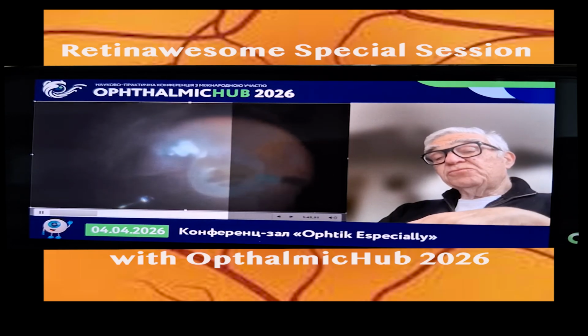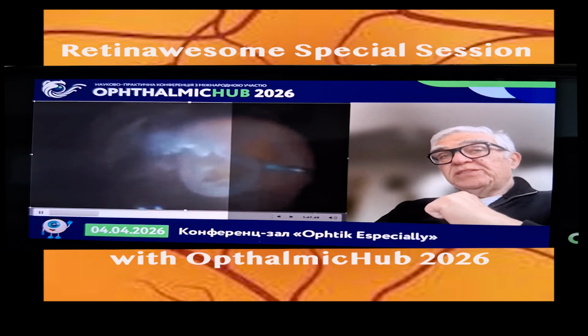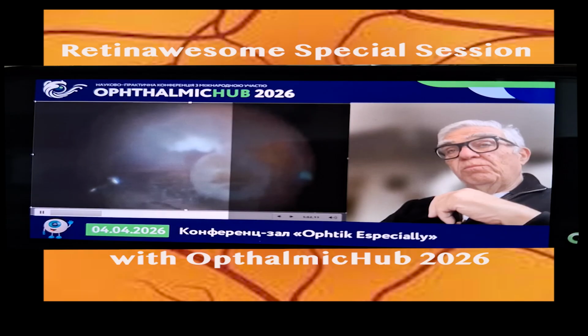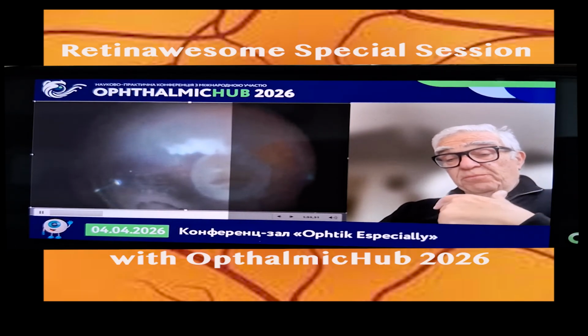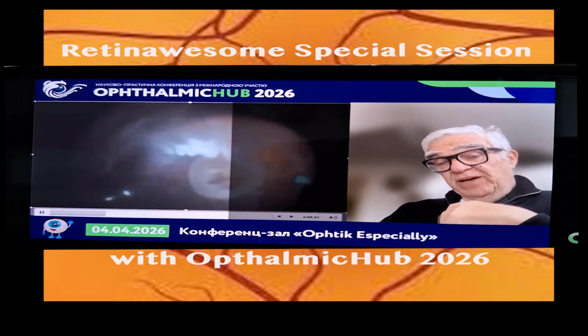We see the negative traction that is done when you squeeze the eye. When you squeeze the eye, you actually suction things when you make a tear. And so by suctioning, now we got another problem. We got a retinal detachment and we got a nucleus in the middle of the eye.